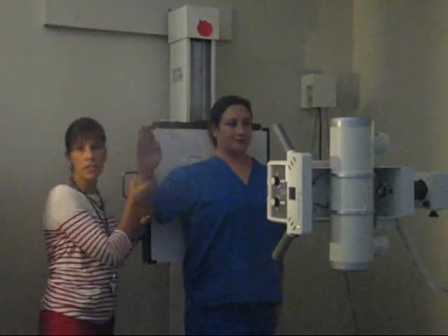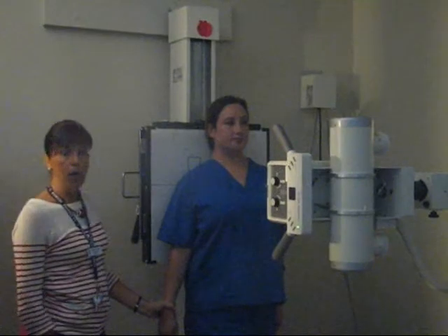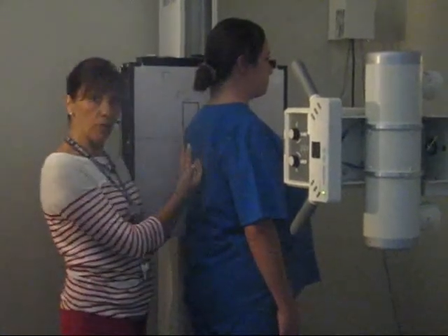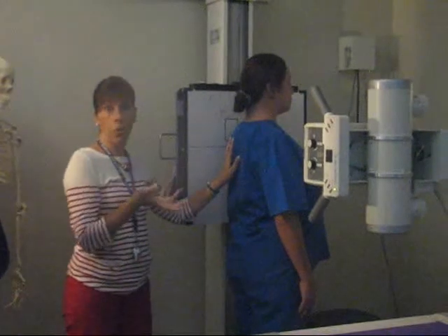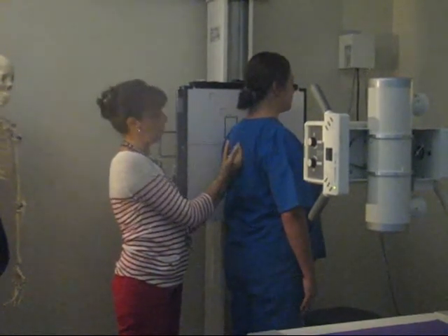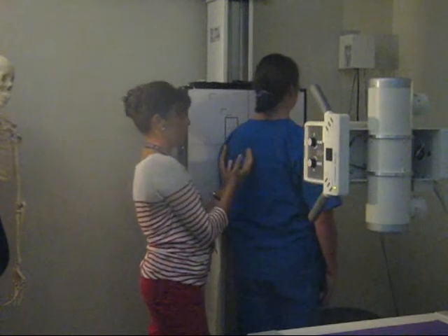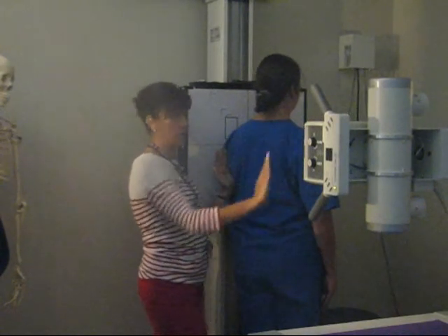Your second position that you need to do with your scapula is a lateral position. And as you can imagine, it's kind of difficult to get a lateral view of your scapula. It's kind of similar to the Y view. In order to see the scapula in a lateral view, you're actually going to have to oblique your patient a little to where the scapula is actually towards the CR.